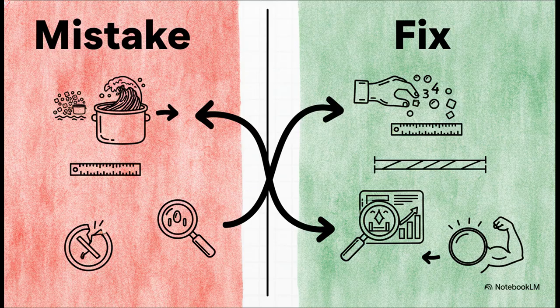Now, of course, there are some common pitfalls. The biggest mistake by far is trying to test everything at once. Don't do it. Start small. Also, make sure your low and high settings are actually different enough to see an effect. And please, please don't just look at raw signal. An immunoassay is always a trade-off. And whatever you do, do not skip the confirmation and stress testing steps. That's how you build a method you can actually believe in.